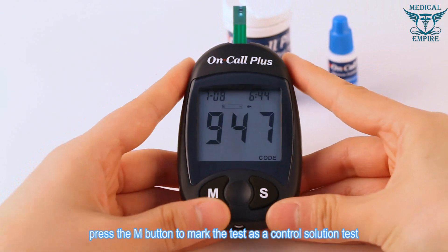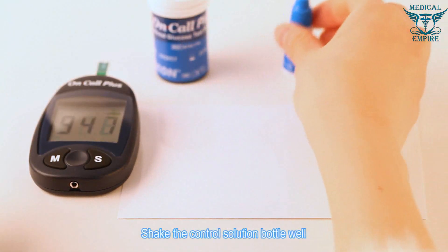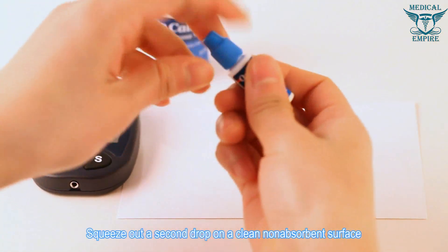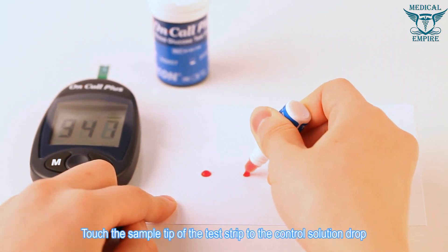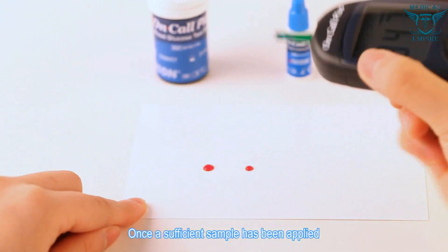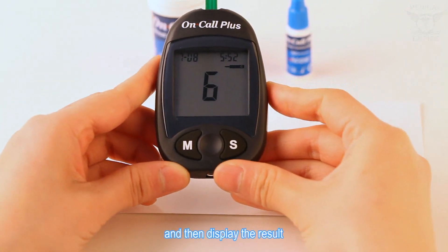When the blinking test strip and blood drop symbol appears, press the M button to mark the test as a control solution test. The control solution symbol will appear on the display. Shake the control solution bottle well, then squeeze and discard the first drop. Squeeze out a second drop on a clean, non-absorbent surface and touch the sample tip of the test strip to the control solution drop.